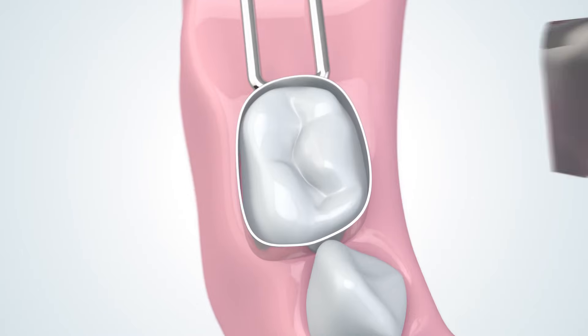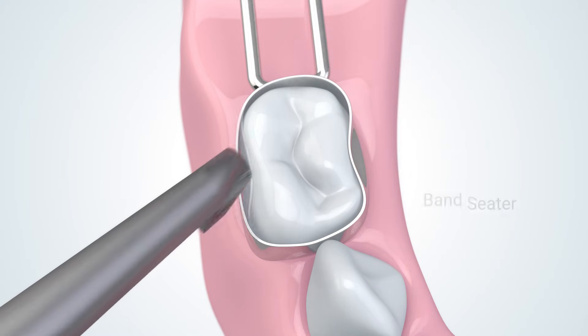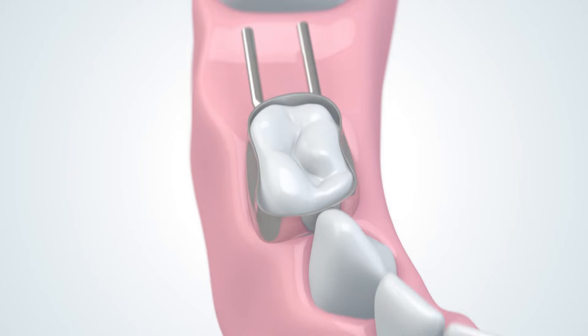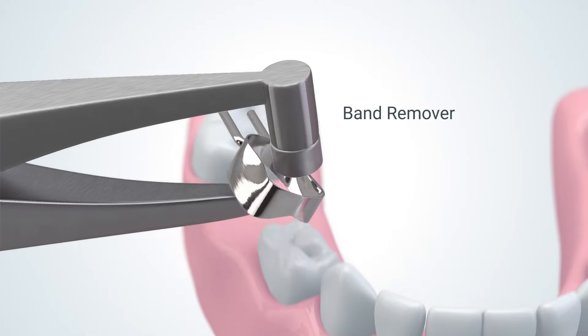Contour the fitted band to match the tooth anatomy with the DeNovo Lightweight Band Seater or a similar instrument. Then remove the fitted band from the mouth with the DeNovo Band Remover, or your preferred method.